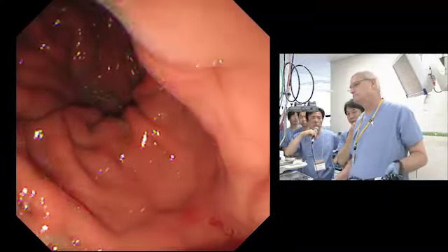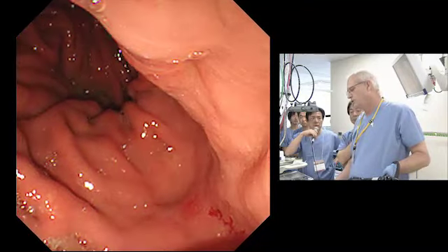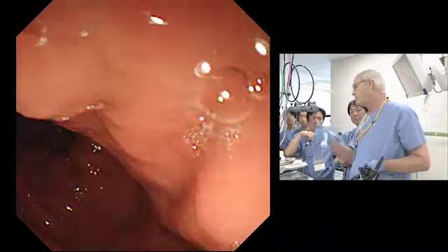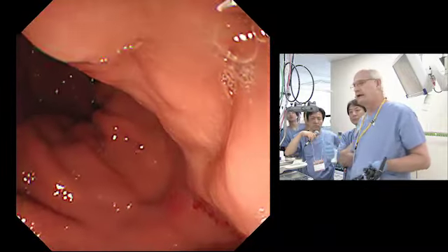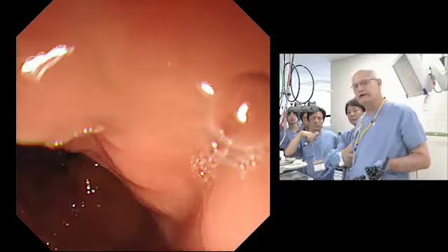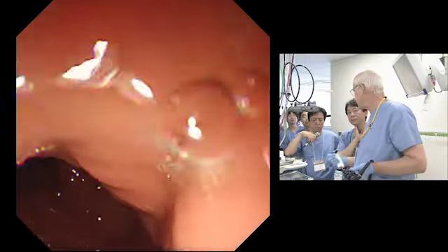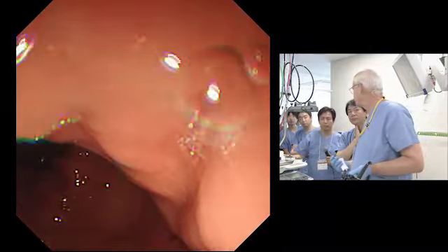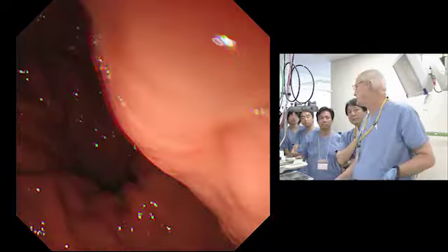Okay, in other words, when do you use radial EUS? So radial EUS I use for the anus, for anal canal evaluation, and for luminal imaging, for the esophagus sometimes, for the bile duct if I just want to see if there are stones. But for me, more and more, it is the linear.